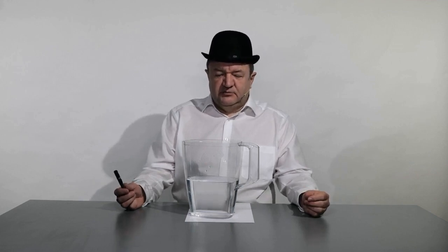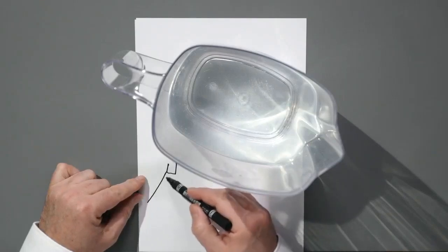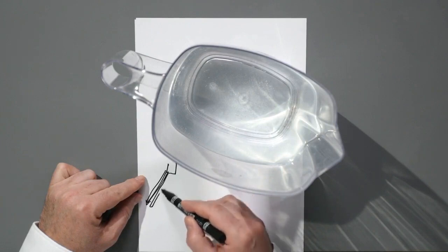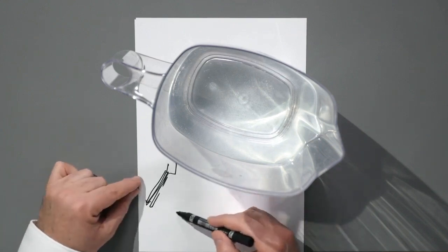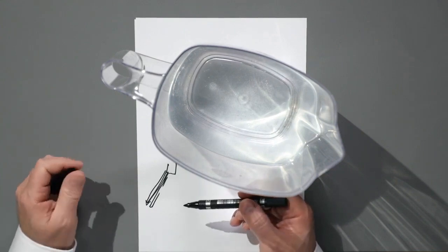As I mentioned in the previous episode, the ultrasound examination uses sound waves that bounce off the transducer in a sector or linear fashion. The sound simply comes out from the transducer, bounces back, and then the next one follows. As a result, an image is created on the screen. At a specific time, an image of those reflected elements appears, and that's relatively easy to understand.